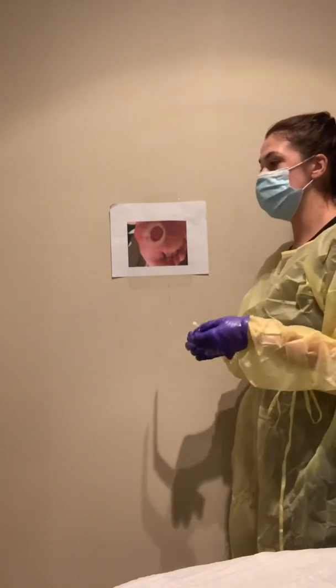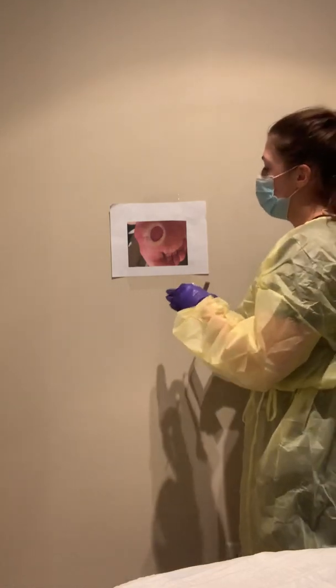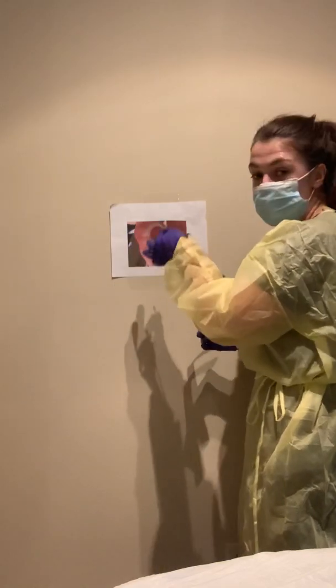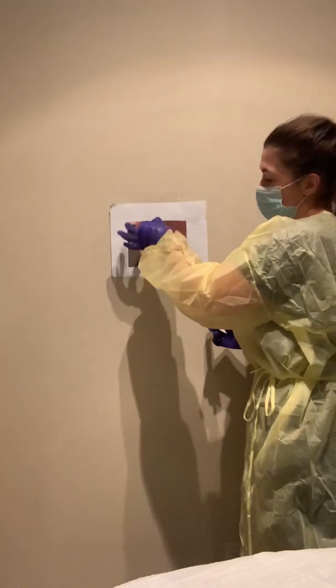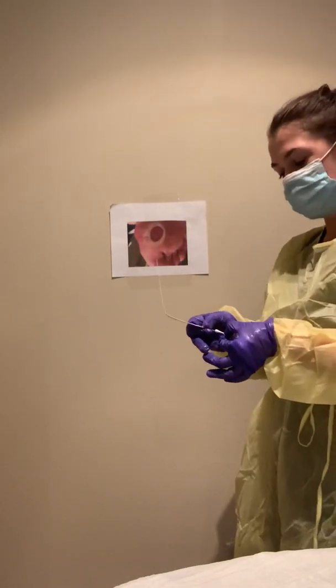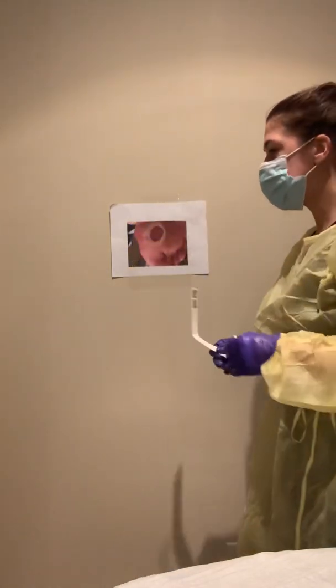It's important as I do this that I find the tunnel at a specific direction, make sure that I go far enough to feel the resistance of where the tunneling ends. From there, I have my thumb there to mark the full length of the tunneling, and I can measure it again with my thumb on the beginning of my ruler this way.